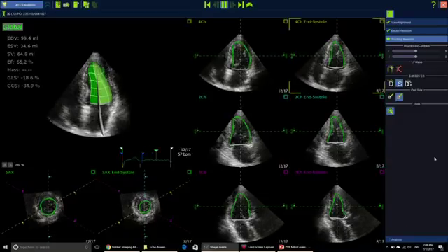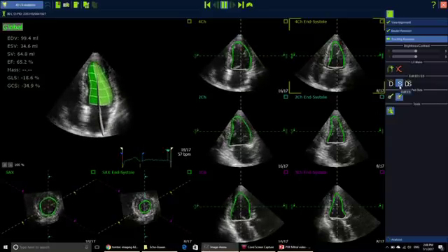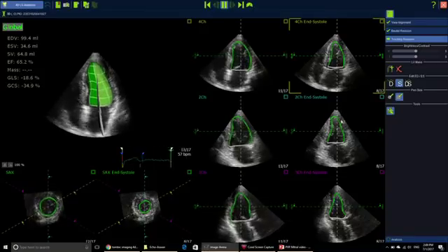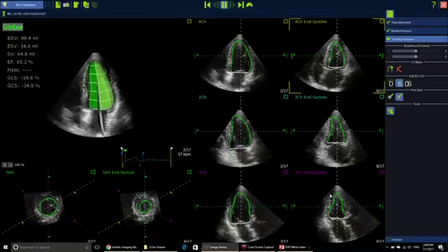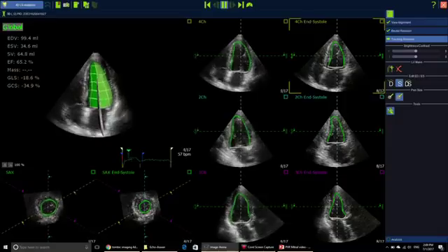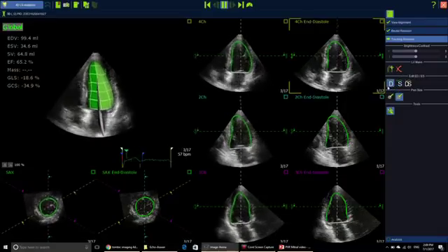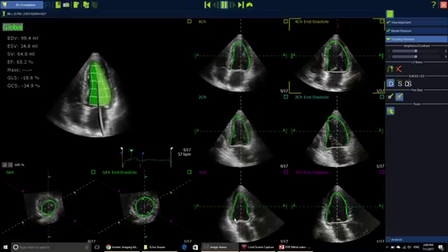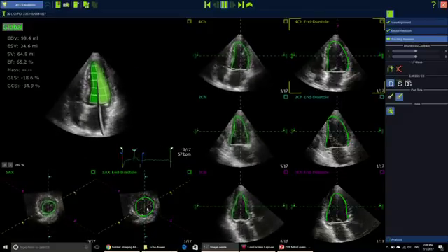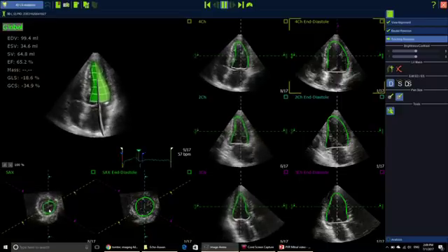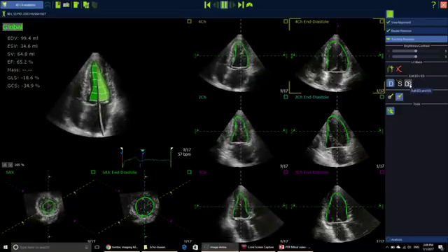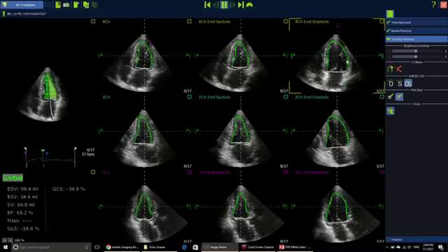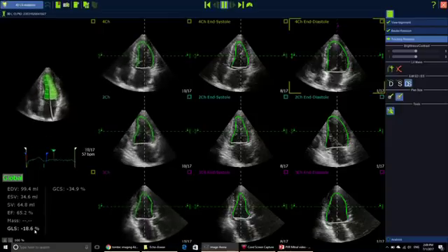Now it is tracking throughout the cardiac cycle. You now have different types of display. If 'systole' is highlighted, you will have an end-systolic fixed frame with a dynamic image and the cast in motion. If you click 'diastole,' it will give you the end-diastolic freeze frame, the dynamic series, the cast, and the dynamic image. If you click 'DNS,' it will give you the diastole, the systole, the dynamic image, the volume, and the results as well.